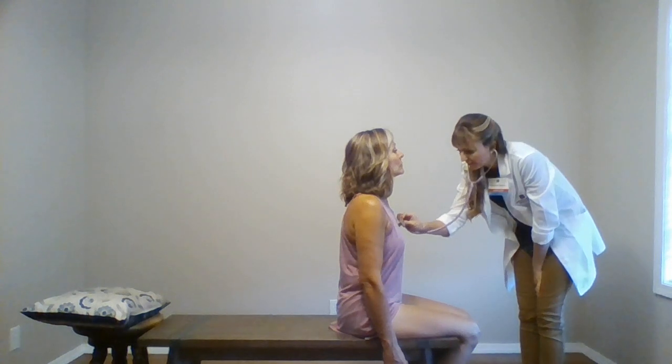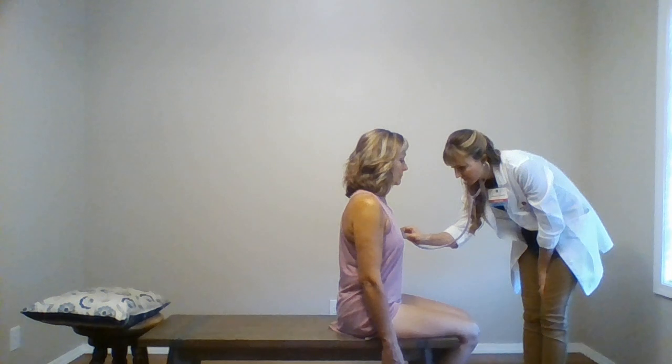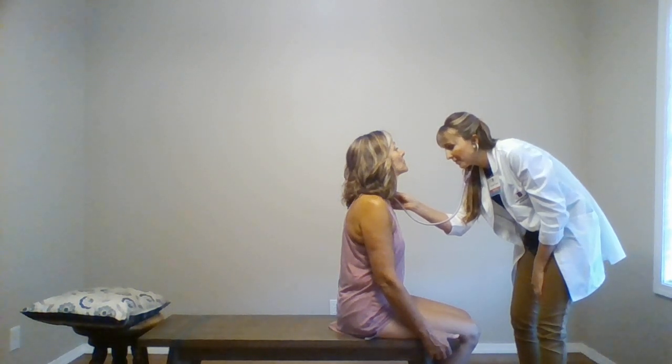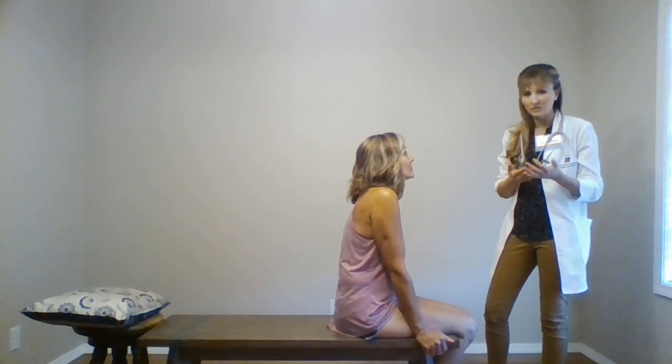I'm going to listen with both the diaphragm and the bell. And while I have my bell ready, this is a good opportunity to listen for carotid bruits. Good. There is a distinct and audible S1 and S2 with no adventitious sounds, nothing that would indicate stenosis or regurgitation. So we'll move on to the abdominal assessment.